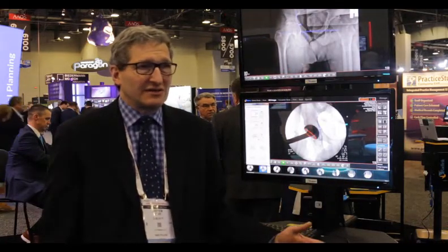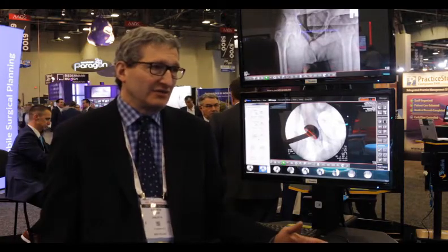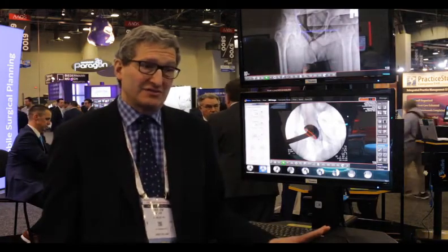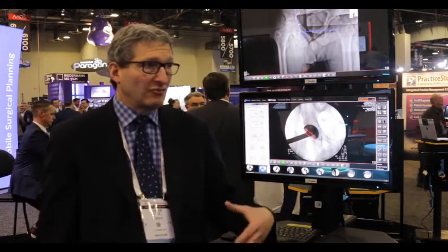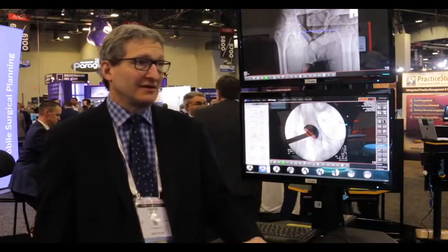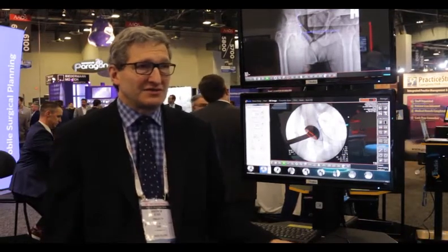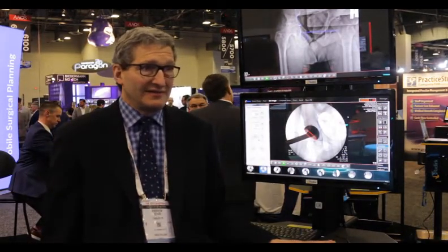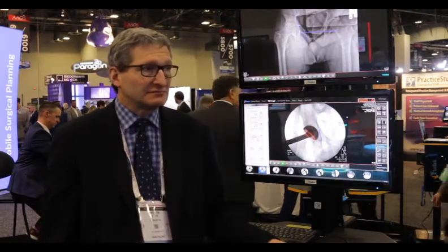But by the same token, I like to look at the anatomy as it stands, and literally look at that, and actually looking forward to some of the new developments, and maybe actually taking a Pano real full-length X-ray. And I think that might be something for the future that we'll see that could also support that. It depends upon the patient. It depends upon whether you're dealing with a patient that's had surgery on the other side and the anatomy is distorted, or whether you can really rely upon the landmarks.